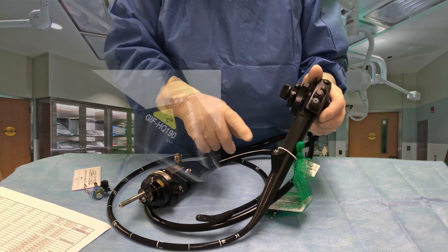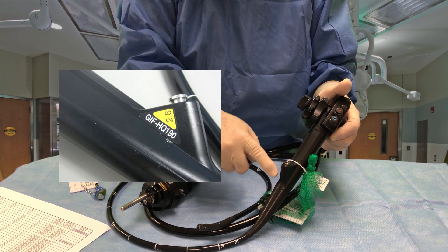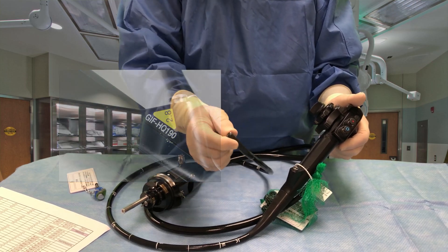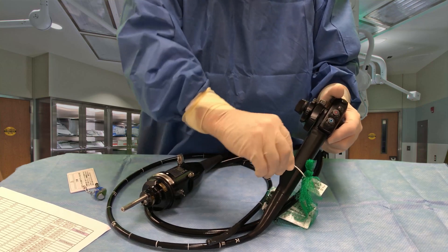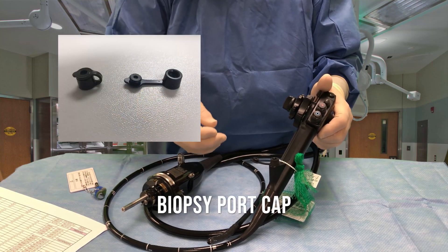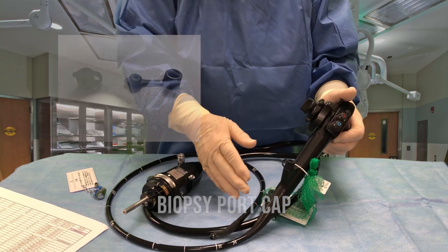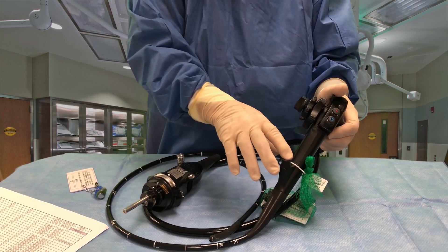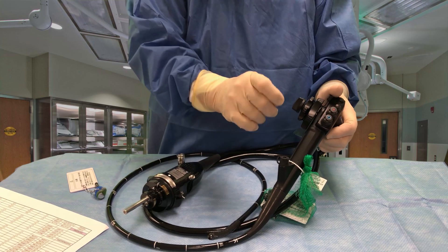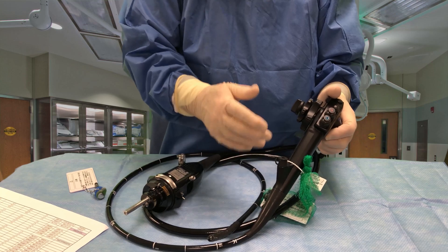The other point of this control handle is it has the biopsy port, as we call it, that enters into the working channel. It starts here and goes out 103 centimeters to the distal tip of the scope. This is the semi-disposable biopsy port. It has a little cap — we push that cap down to ensure that CO2 doesn't come back up when we're trying to insufflate. It also allows us to put in biopsy forceps, snares, and other instruments that fit into a 2.8 channel without losing any CO2.